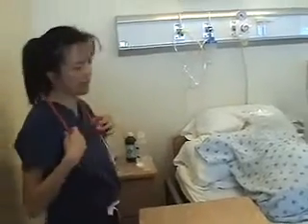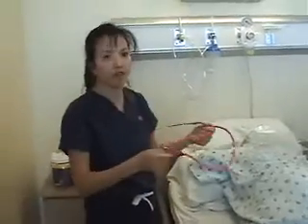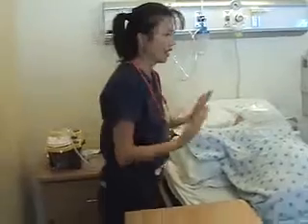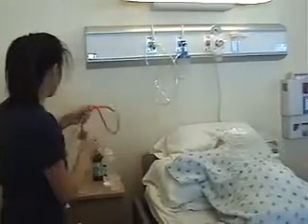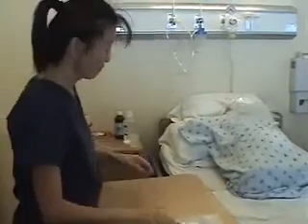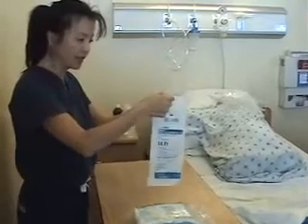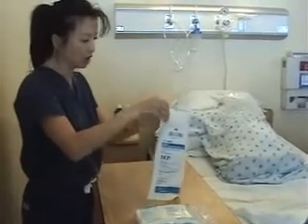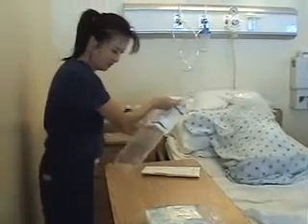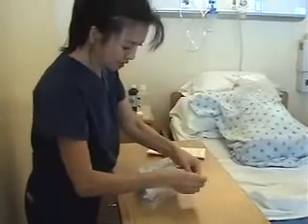I want to really be comfortable, and maybe just take your stethoscopes off if you need to, so you're comfortable, right? You don't want things dangling. I always want to make sure I am comfortable. This is the suctioning kit. So I'm going to use this first, so I'm going to place this closer to me. Preparations.